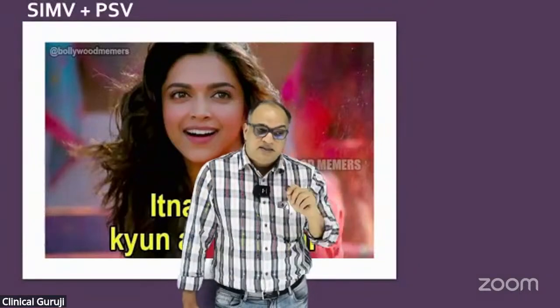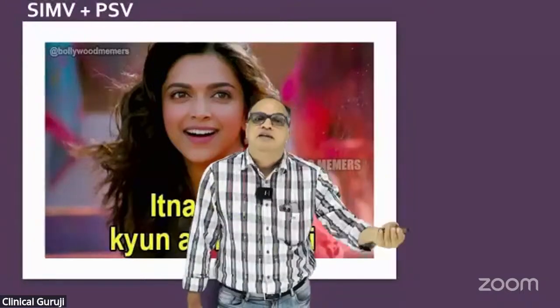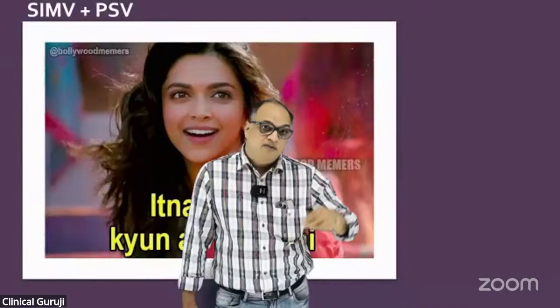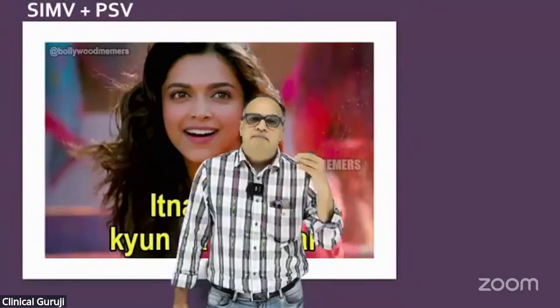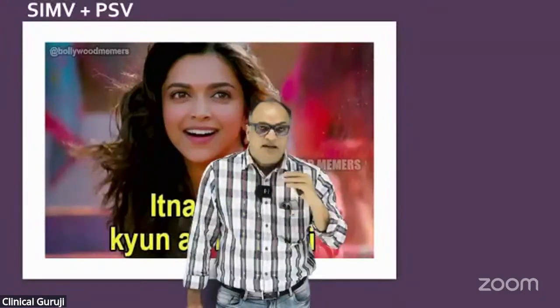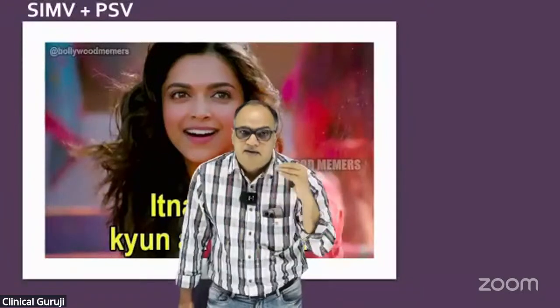In a spontaneously breathing patient, ACMV might be a little troublesome because it will hyperventilate the patient. In a spontaneously breathing patient, the best thing is SIMV plus PSV. Why? Because SIMV will guarantee the minimum mandatory ventilation of, let's say, 500 into 12, and PSV will make sure that every effort is recognized and respected.